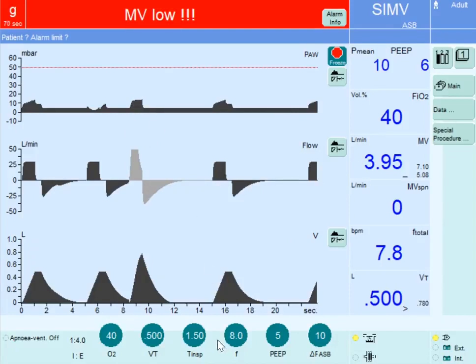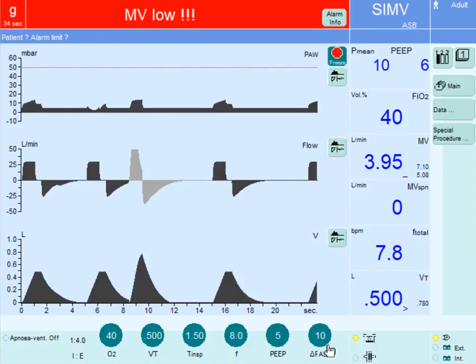For the pressure-supported breath, the inspiratory time is not fixed at 1.5 seconds; it is determined by the patient's inspiratory flow. Once the flow reaches 25% of the maximum inspiratory flow — a threshold adjustable on certain ventilators — the pressure is released and the breath ends. Notice that the patient delivered a larger tidal volume than 500 ml during this pressure-supported effort. The pressure support level can be adjusted based on the patient's condition. In the following breath, 7.5 seconds elapsed with no patient effort, so a mandatory breath was given that is time-triggered, flow-limited, volume-controlled, and time-cycled.